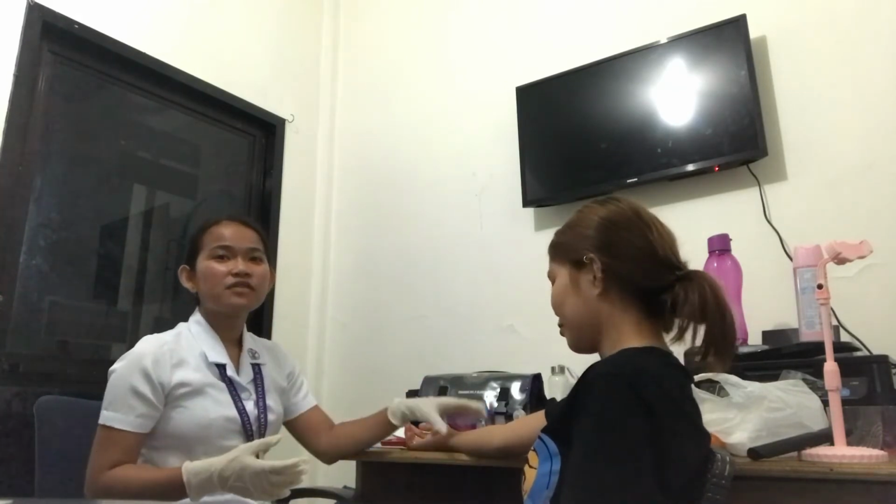After that, we need to assist the client to a comfortable position and indicate the site and due time for reading. We don't need to recap the used needle. Discard the needle and syringe in the appropriate receptacle, wash hands, document the procedure, and interpret the result after 30 minutes.